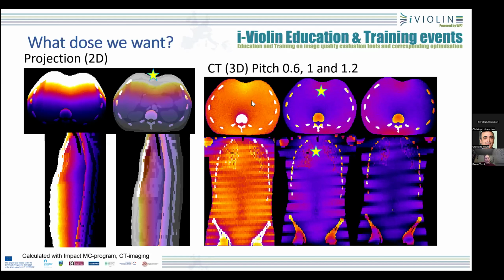In CT, the situation is a little bit better because, as you can see, the dose distribution inside the patient is a little bit nicer. It's not flat for sure, not uniform, but it's somehow more equally distributed when the X-ray tube is rotating around the patient. So there we have some variation in the Z, Y and X direction, but our dose quantities are actually estimating the dose in the, sorry, my animation is not working, but the stars should go around. So our dose quantities, the measurable quantities, are actually estimating the dose in a larger volume.